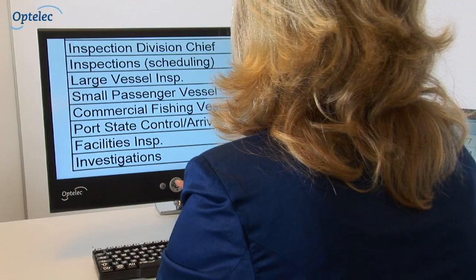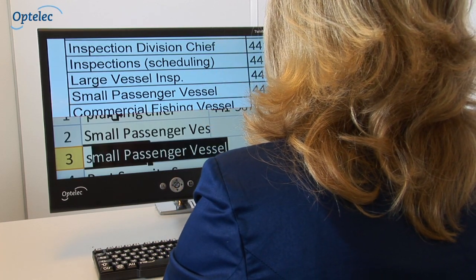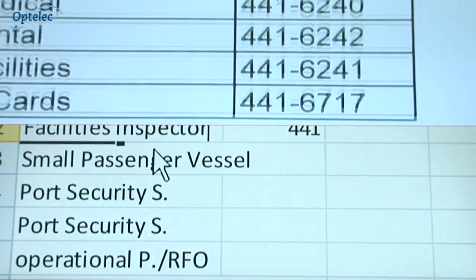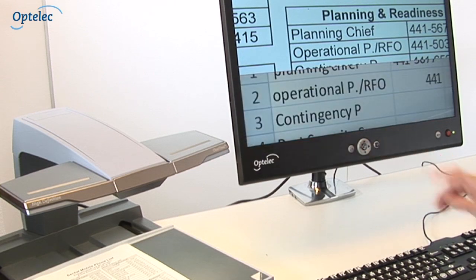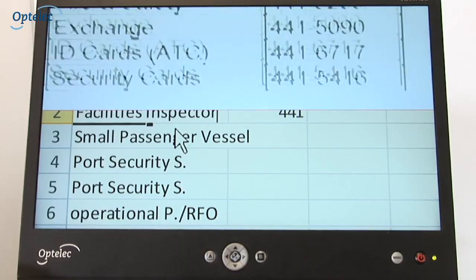Press the AB button to view the images from both the video magnifier and the computer at the same time using the TwinView. You can choose whether the screens are split vertically or horizontally. Split screen can be very useful when, for example, copying information from a form or a letter, or when viewing information from books, graphs, and reports.